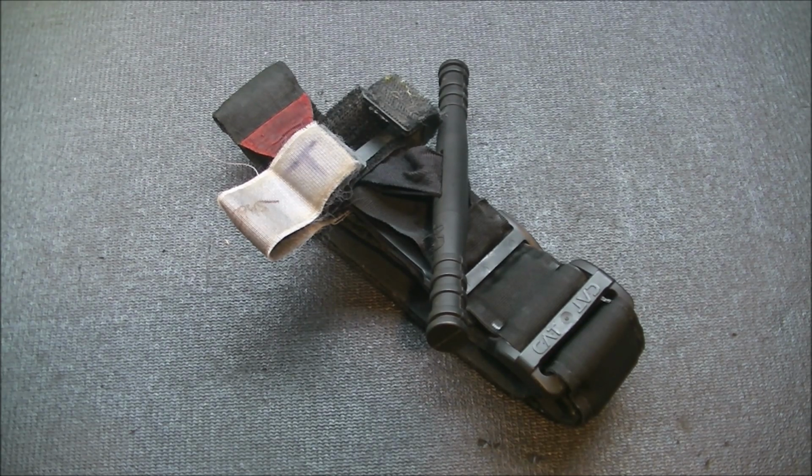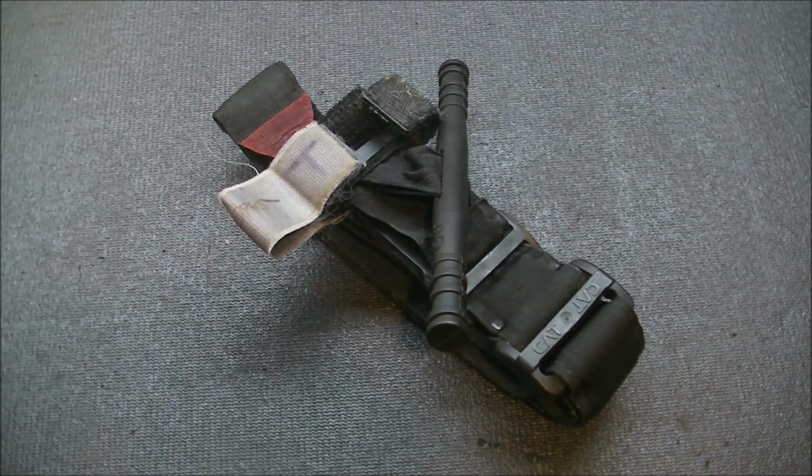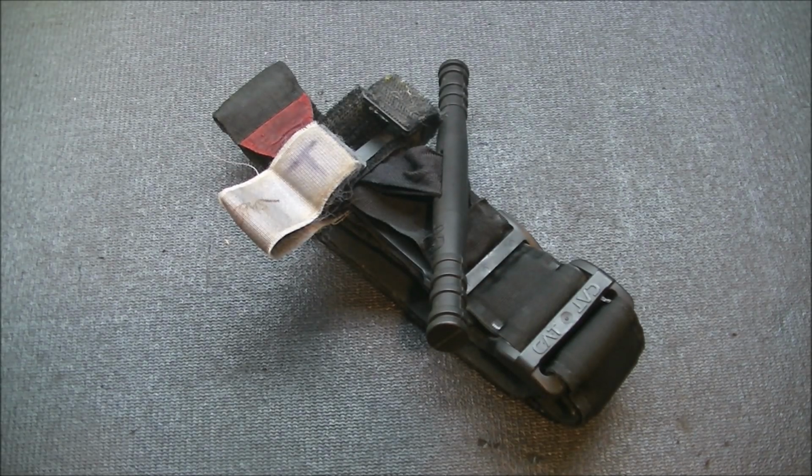Or not the windlass, but the internal piece here on the knockoff tourniquet actually broke, and so it just lost all of its tension. Also, these are single-use items, so you're not going to be training with the tourniquet you're going to use, right? Because it's not designed to actually be used multiple times. It's made just well enough to be reliable for one use, for the most part.